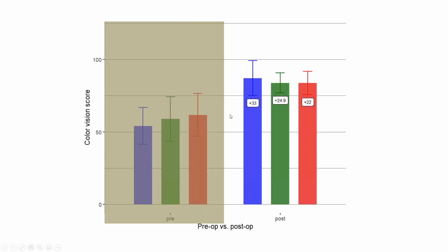So the way that I look at this, even though I don't practice cataract surgery, in the US, retina specialists don't tend to practice cataract surgery. I know in the rest of the world, retina specialists do a lot of cataract surgery. But the way that I use cone contrast threshold testing in my practice with other diseases is basically looking at how much contrast they can see and how much of a fall risk they might be.